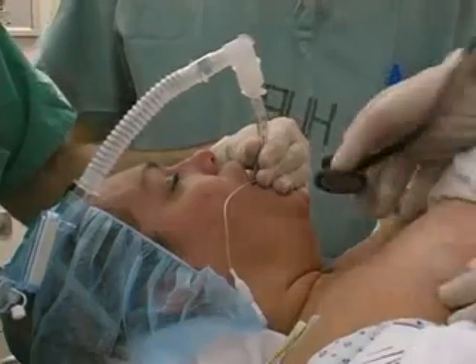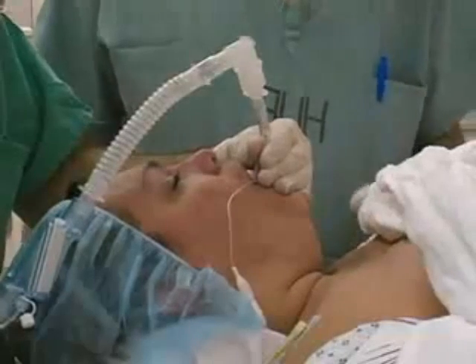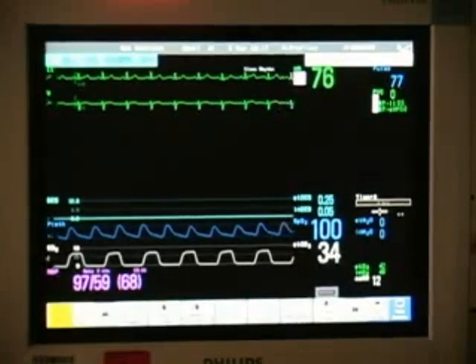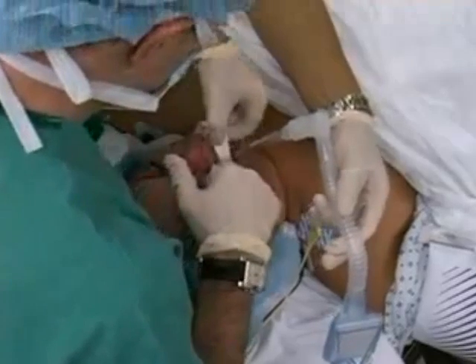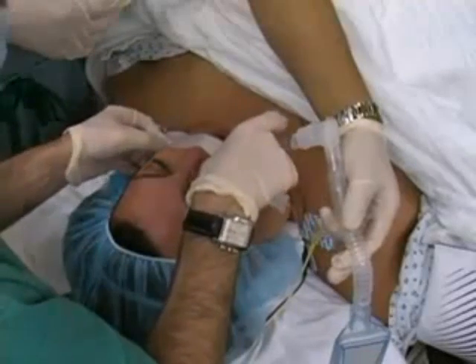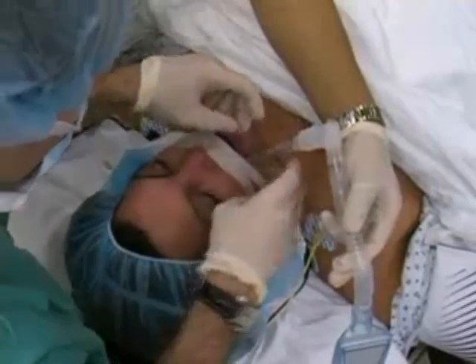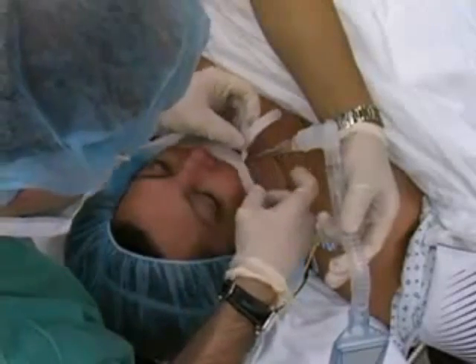Confirm successful ventilation by watching for chest rise and auscultating the lungs bilaterally. Verify ventilation by checking the monitor for the presence of end tidal carbon dioxide. Remove the dental guard and inspect the teeth for incidental damage. Secure the tube with tape, fixing it to the patient's cheek and upper lip around the endotracheal tube and again to the upper lip and opposite cheek.